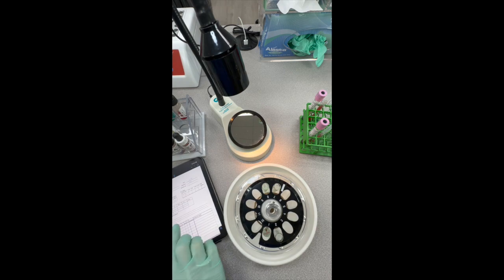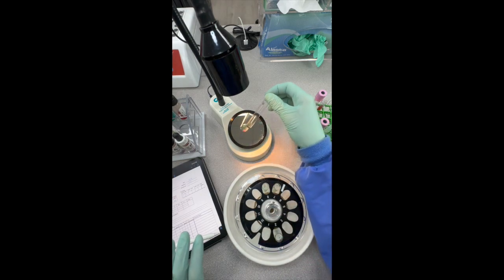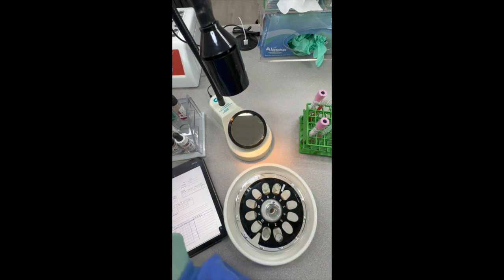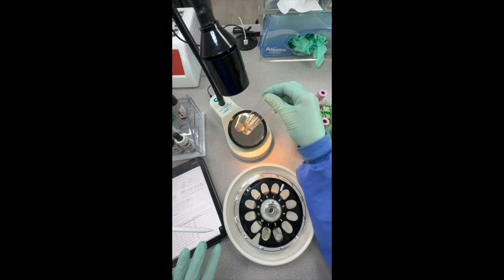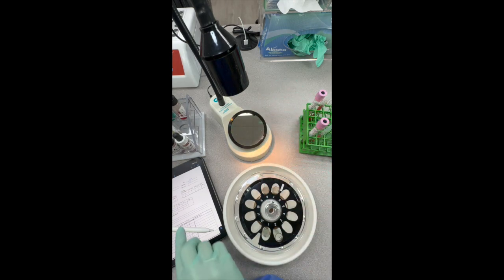So 2+. But let's check our control, and our control needs to be negative. Okay, and very good. There's negative in that control. So we'll record that. Let's go ahead and check our C, and both of these are coming off completely negative. So our C patient, completely negative here.